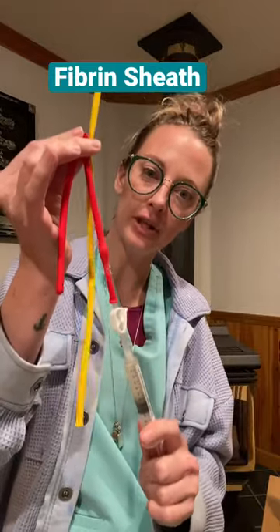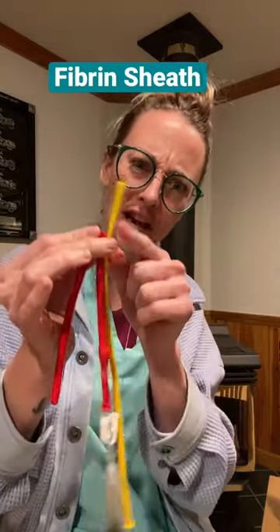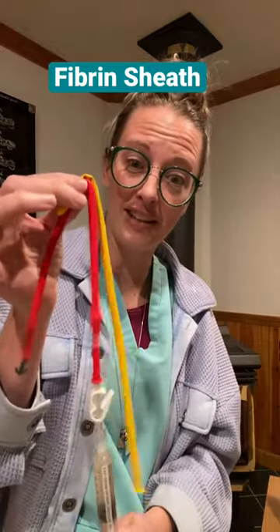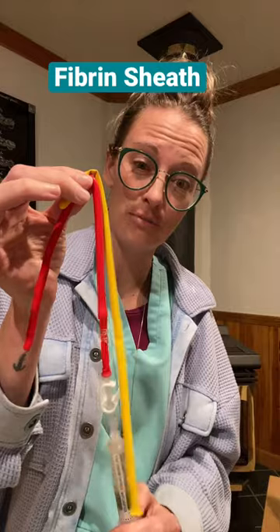If I'm pulling the blood out, the tail tries to go in with it, but it's stuck to the catheter and it just restricts blood flow.